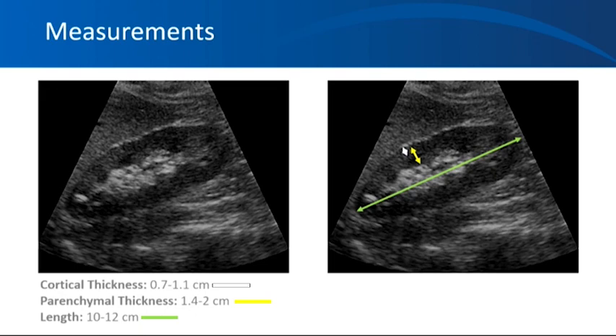If you are not able to see the medullary pyramids clearly, you can use parenchymal thickness, which is the thickness of the whole renal parenchyma and acts as a surrogate for cortical thickness. For parenchymal thickness, measure from the outer margin of the kidney to the tip of the pyramid. If you cannot see the pyramids clearly, measure until you see the sinus fat. Normal parenchymal thickness is about 1.4 to 2 centimeters — almost twice as much as cortical thickness.